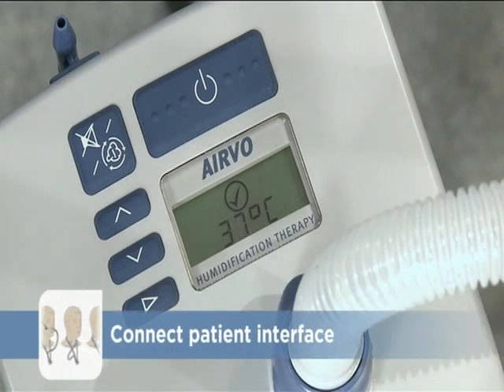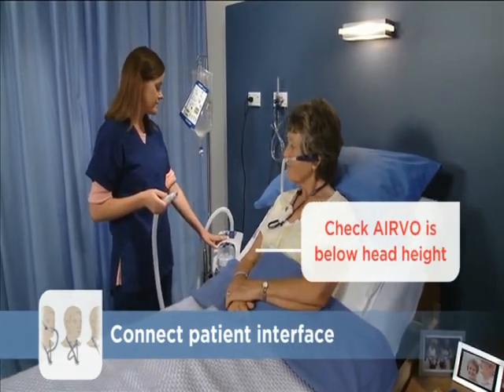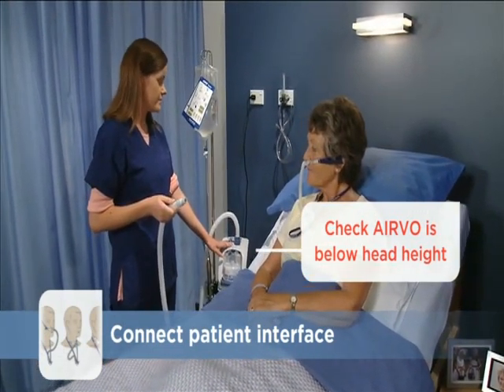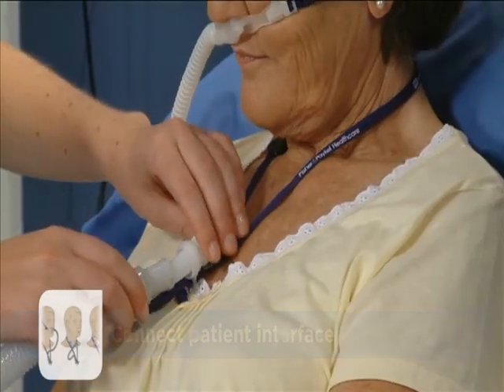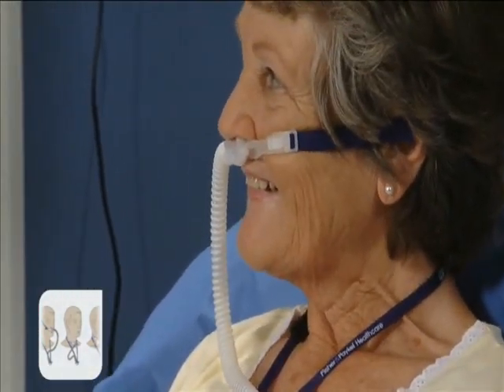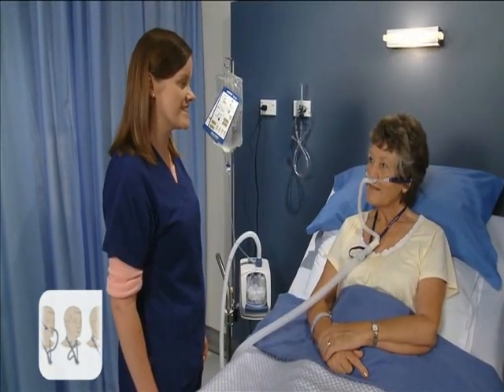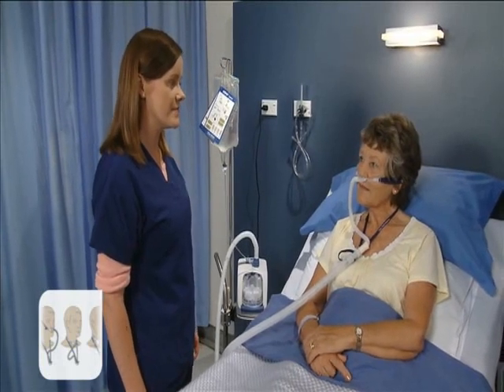The ready-for-use symbol indicates that you can connect the breathing tube to the patient interface. But first, check that the Evo will be below the patient's head height, so water cannot enter the breathing tube if the unit gets knocked over. Attach the breathing tube to the patient interface by simply pushing the two connectors together until you hear a click. The gas delivered will feel warm when the patient first uses the unit — this is typical, and they should simply continue to breathe normally.